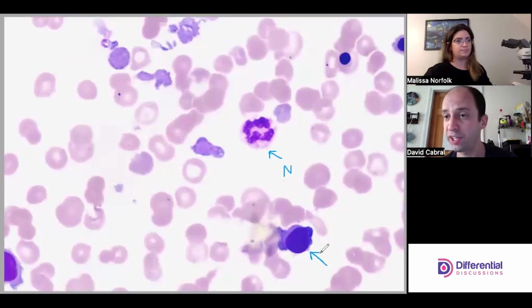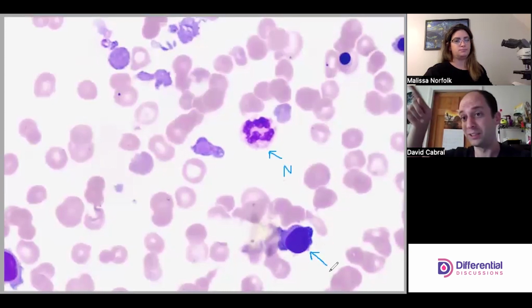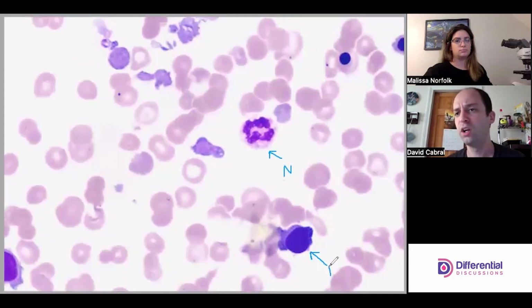It is not just the video. It is not just the recording. It is almost impossible to see any of the real detail inside that nucleus. And then what do we have in the cytoplasm? We have those little blebs, right? So I would automatically put it in the bucket of micro megakaryoblast, or if you had other as a category, whatever. This is the bird of that feather that we saw in the last field.